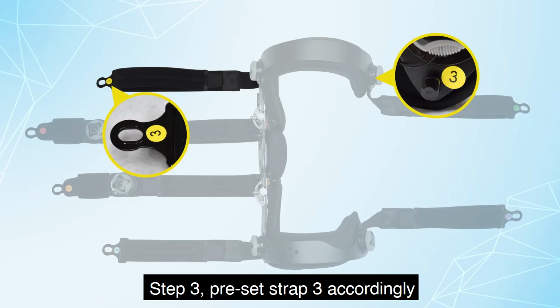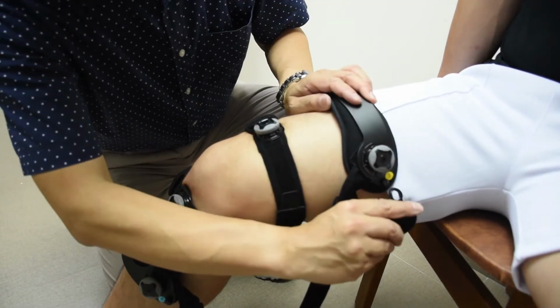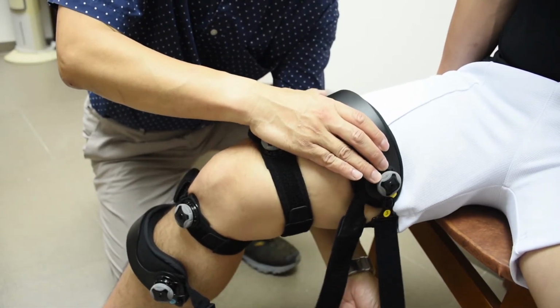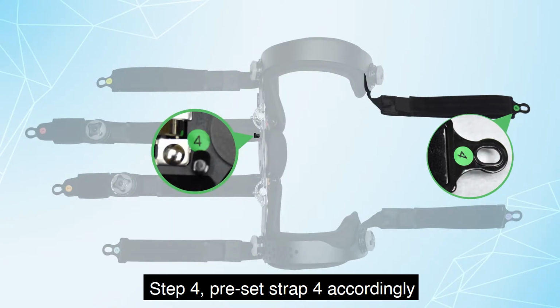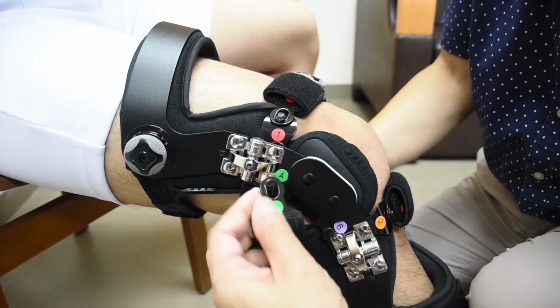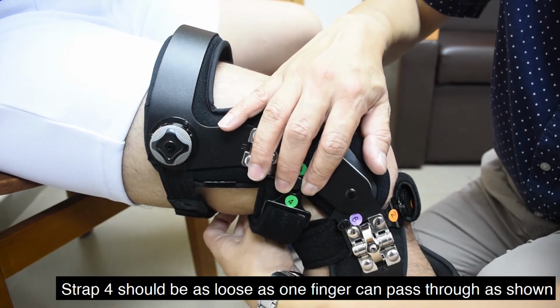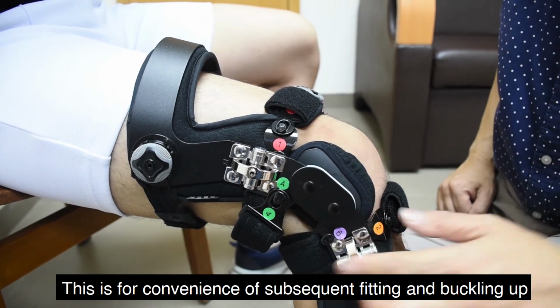Step 3. Preset strap 3 accordingly. Step 4. Preset strap 4 accordingly. Strap 4 should be as loose as one finger can pass through as shown. This is for convenience of subsequent fitting and buckling up.